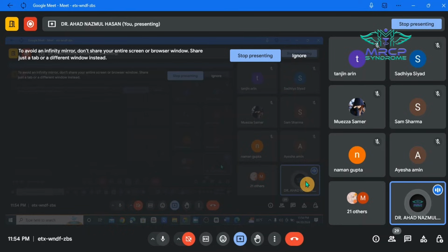In case of T2, they are two persons, partners, so usually they are happy, usually bright, and they use Fair and Lovely to impress others. So in T2, water or CSF will appear bright. T1: depressed, single, no partner, dark. T2: two partners, happy, fair, bright.